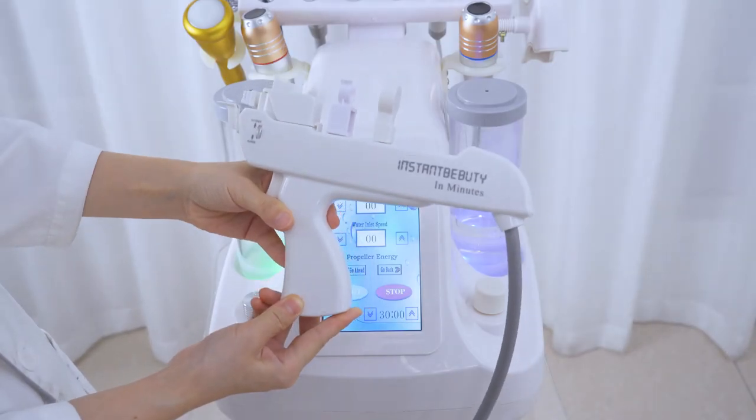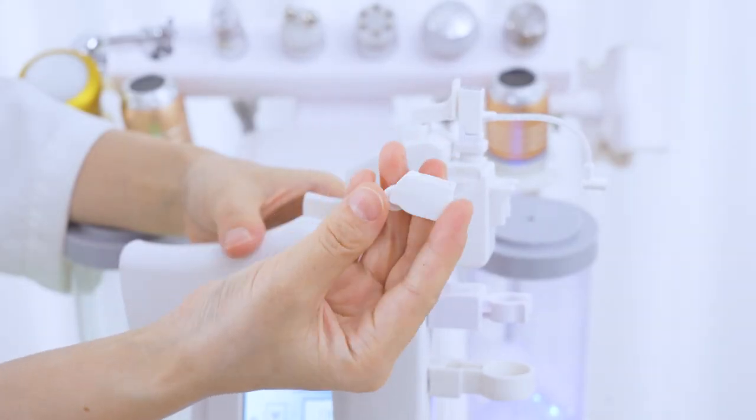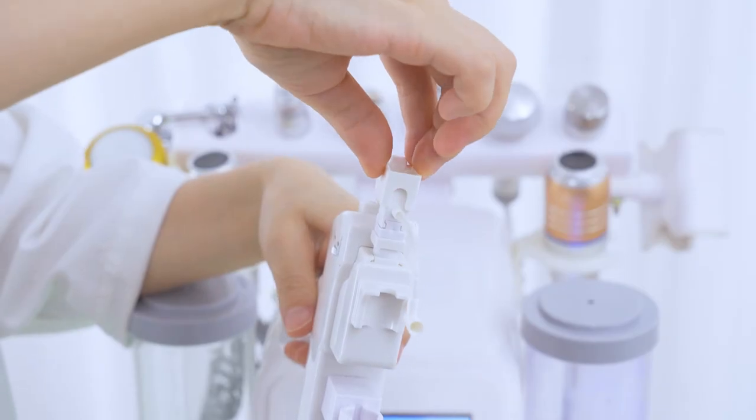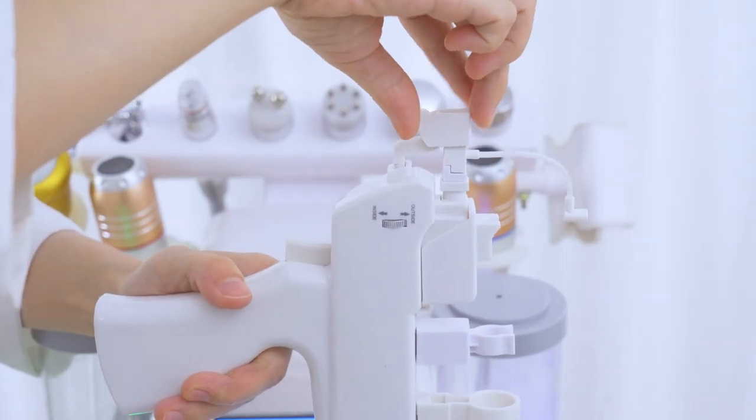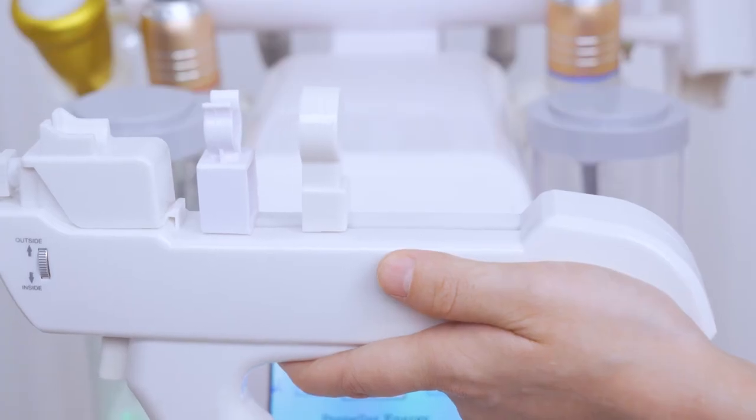Install the accessories: firstly install the microchip, then mount the positioner properly. Click go back on the screen and the thruster will slowly push back.